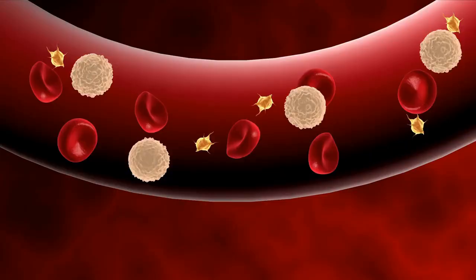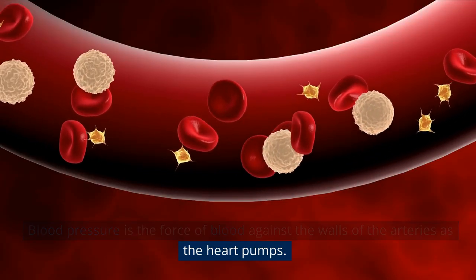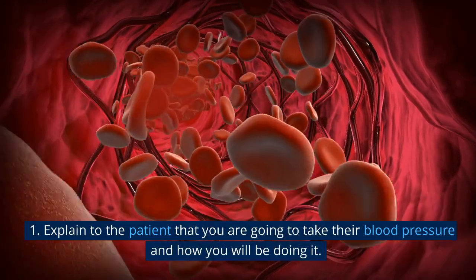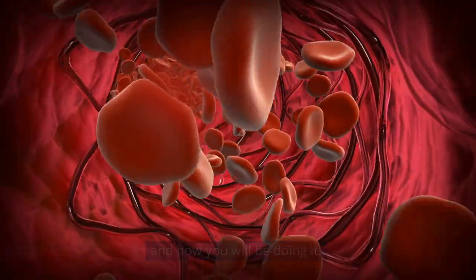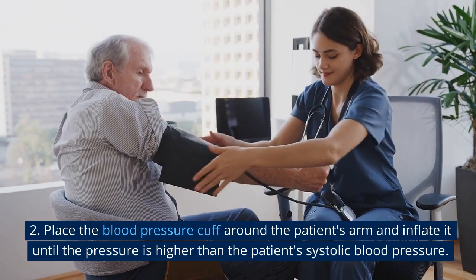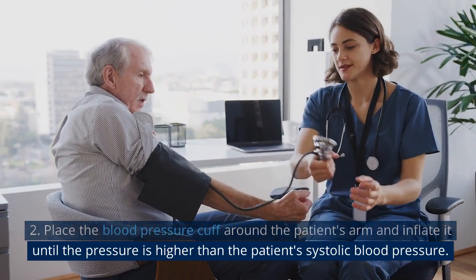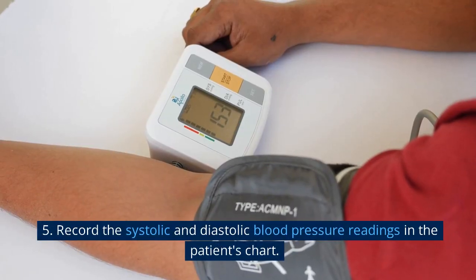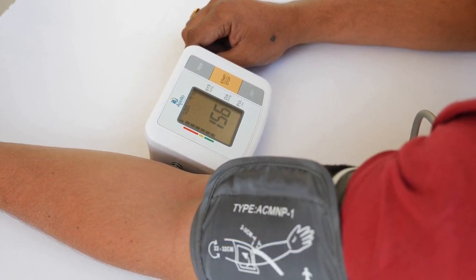Blood pressure. Blood pressure is the force of blood against the walls of the arteries as the heart pumps. Step 1: Explain to the patient that you are going to take their blood pressure and how you will be doing it. Step 2: Place the blood pressure cuff around the patient's arm and inflate it until the pressure is higher than the patient's systolic blood pressure. Step 5: Record the systolic and diastolic blood pressure readings in the patient's chart.